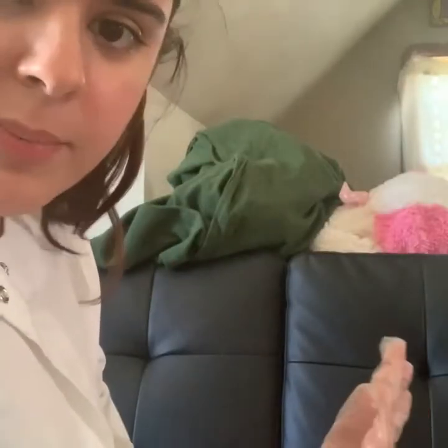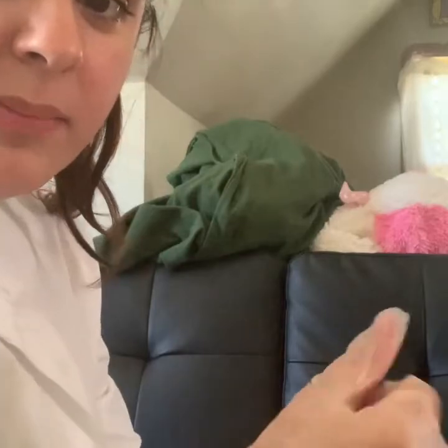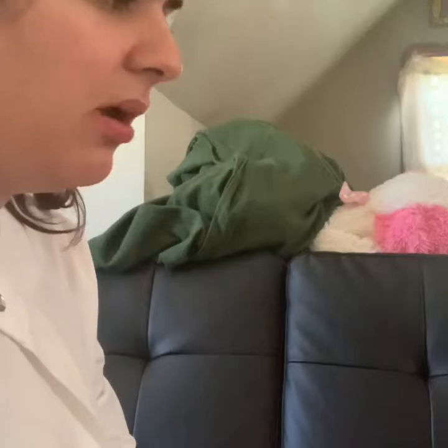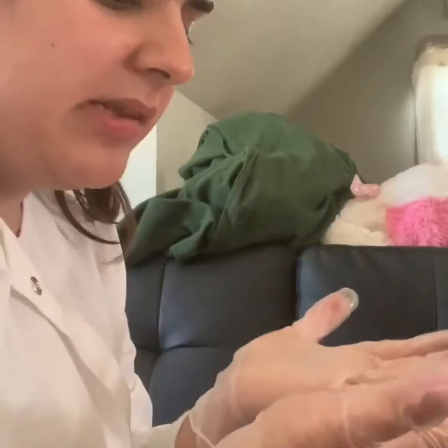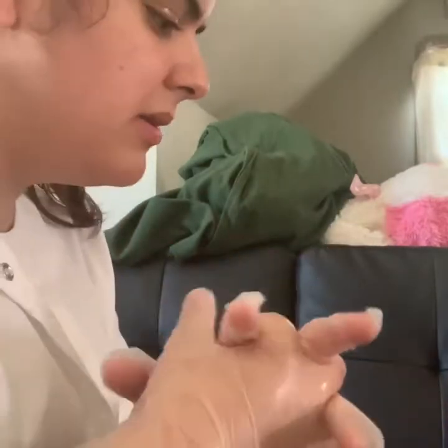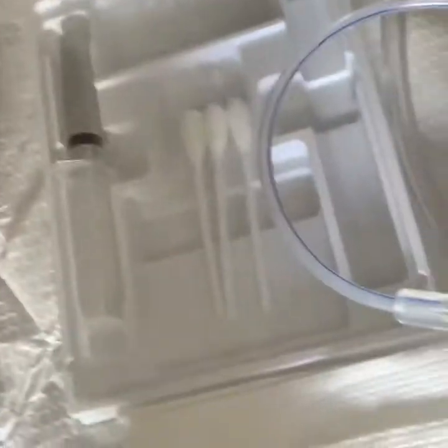So now we're at the part where we're actually placing the catheter. I had to move some stuff around just to get a better video of what's going on for school purposes. He's on my futon now because it was too hard in that area. I would keep my hands above waist level because that's the sterile field. I've moved my sterile supplies over here — I have all my supplies ready, just moved over.